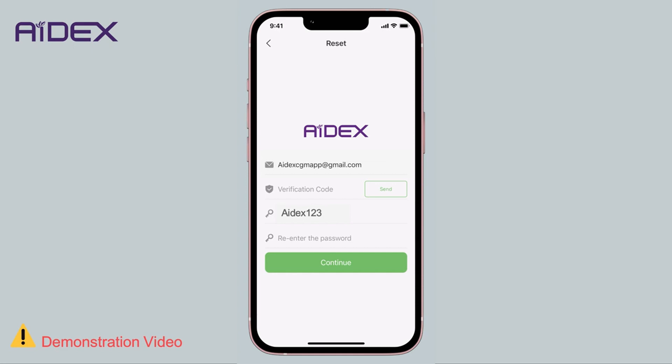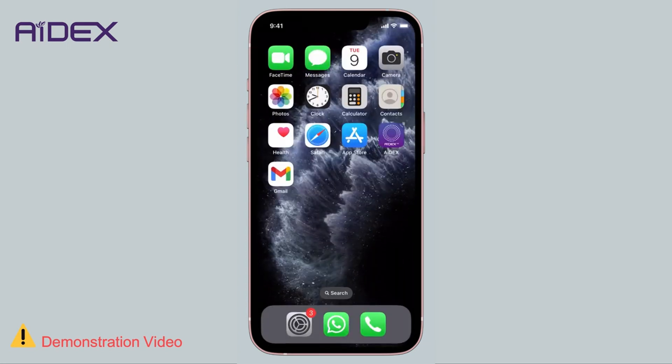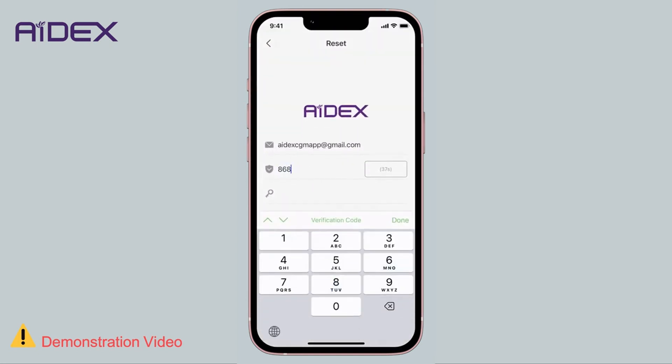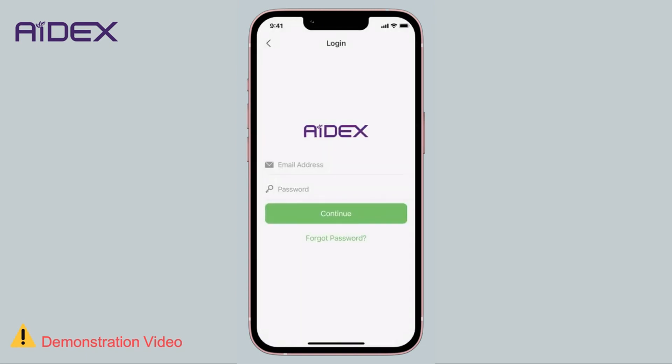If the app detects that the new password matches the old one, it will reject it. Enter the new password again and tap 'Send Verification Code'. Retrieve the verification code from your email and input it into the designated field in the 8X app. Note that there is no checkbox for terms and conditions, as was the case when creating a new account.